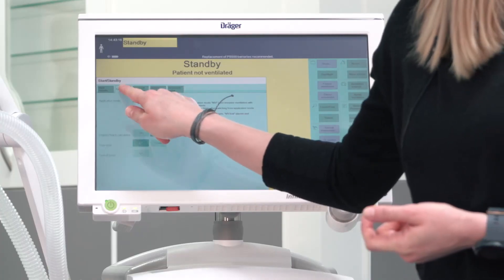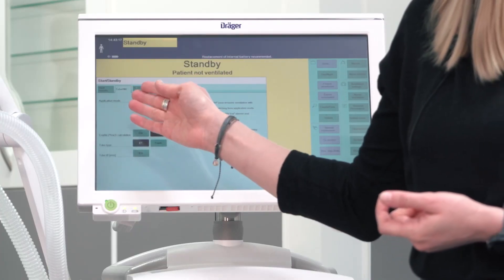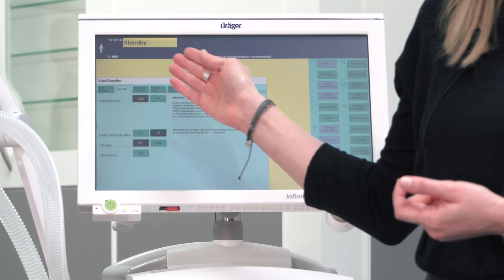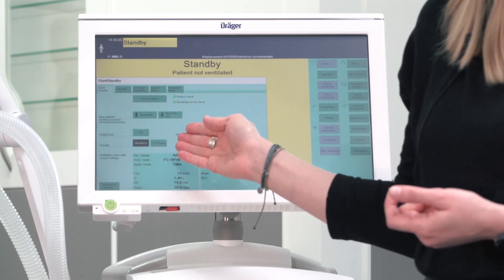The subject of this video is patient admission and the start of ventilation. The Evita features three different therapy types: tube for intubated patients, noninvasive ventilation, and O2 therapy for high flow nasal cannula. You can set the therapy type in the menu under tube, NIV, or directly on the start standby page for O2 therapy, depending on the therapy type you would like to choose for your patient.